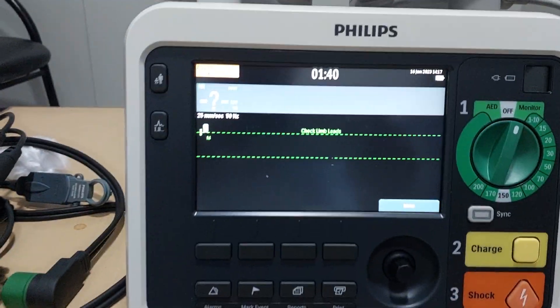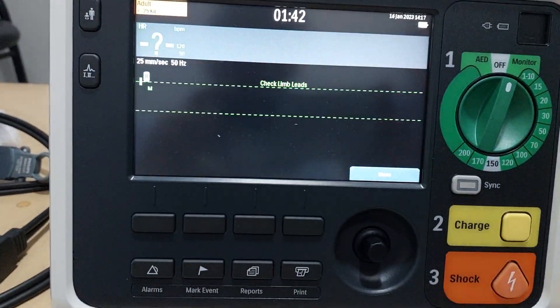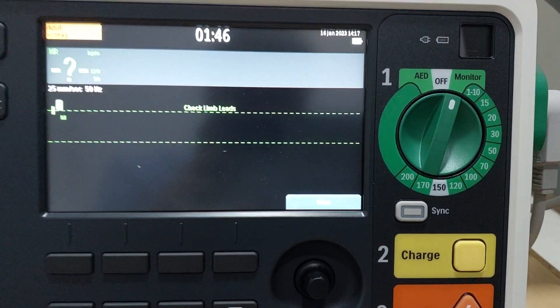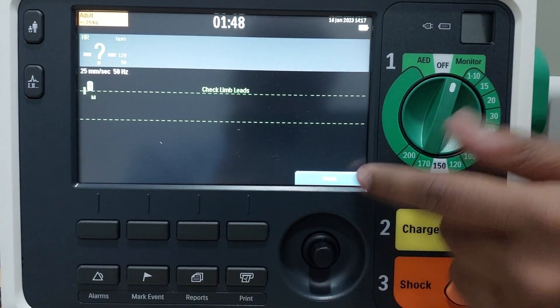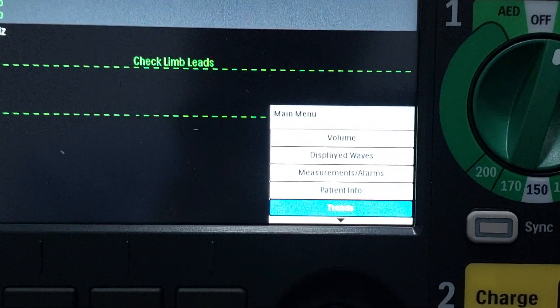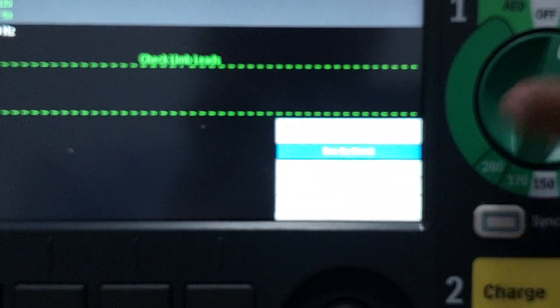Before using this defibrillator daily, you have to perform a pre-use operational test. How to check it: you can observe the menu button — go into the menu, rotate the knob, and you will observe an option called 'Other'. Go into 'Other' and there is 'Operational Check'. Go into operational check and select 'Run Operational Check' — click it.